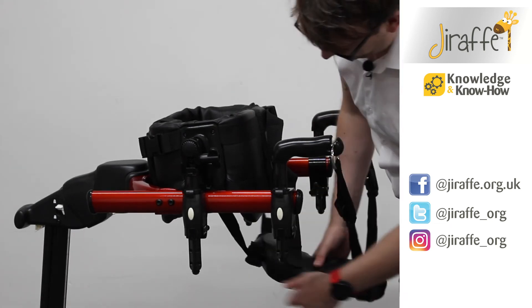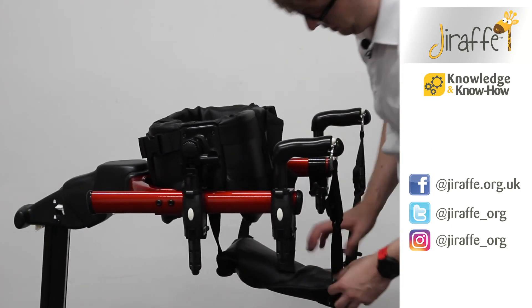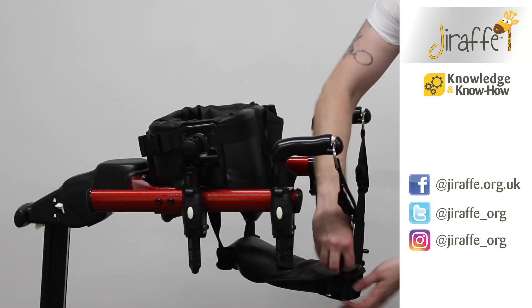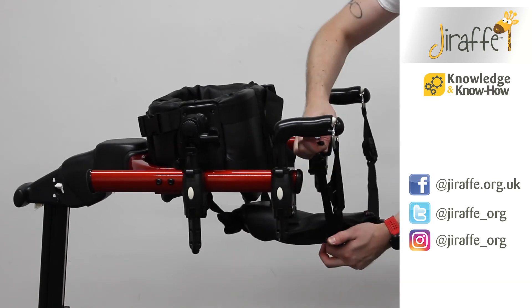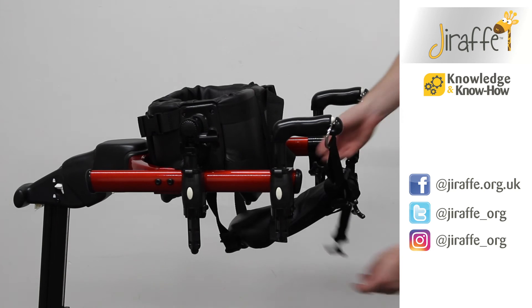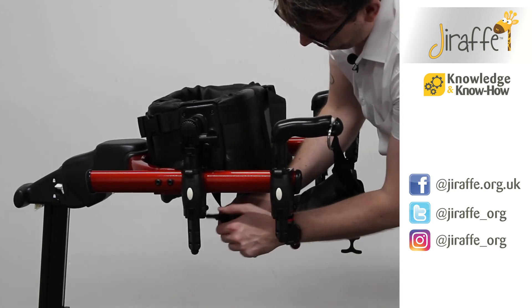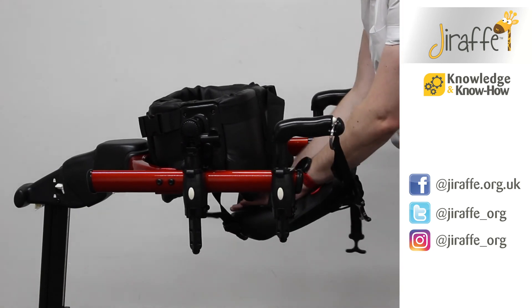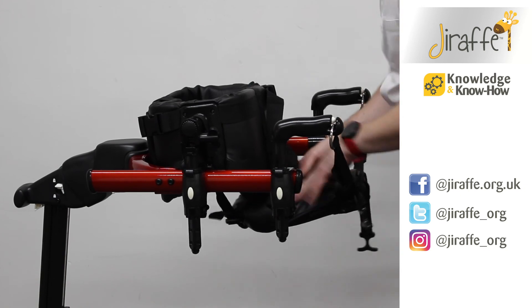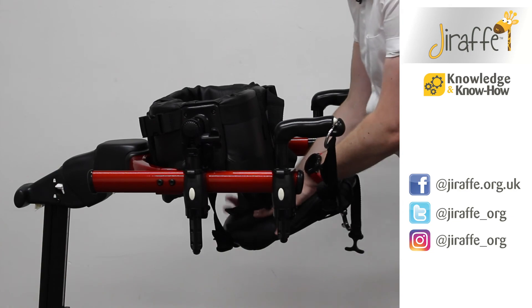We're able to adjust each of the straps in length. If we needed to tighten the back straps, we have a plastic fitting that we can pull in order to tighten those straps. At the front of the strap, we have two additional straps that we can pull. To loosen those, we simply apply pressure to the fittings.